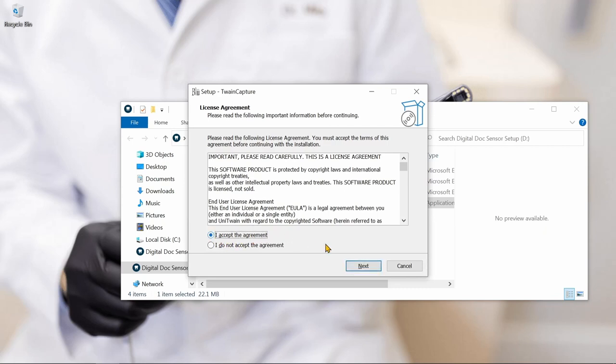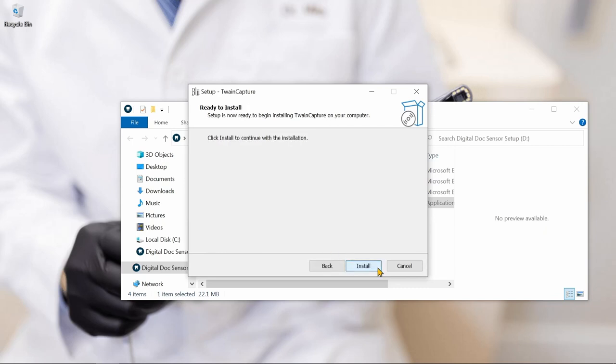We'll click Accept for the license agreement, click Next, and then Install.